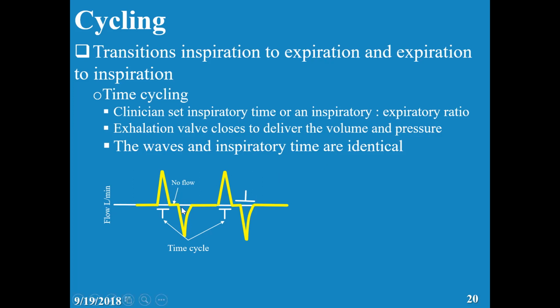However, this pause should not be prolonged. The reason is that the baby starts to breathe in and then wants to breathe out, and then there is a hold. The machine is not allowing it, so it will not be comfortable. So if you prolong this, you can see the baby breathing in, and then he has to hold and then expire. Also, you cannot make it right away.